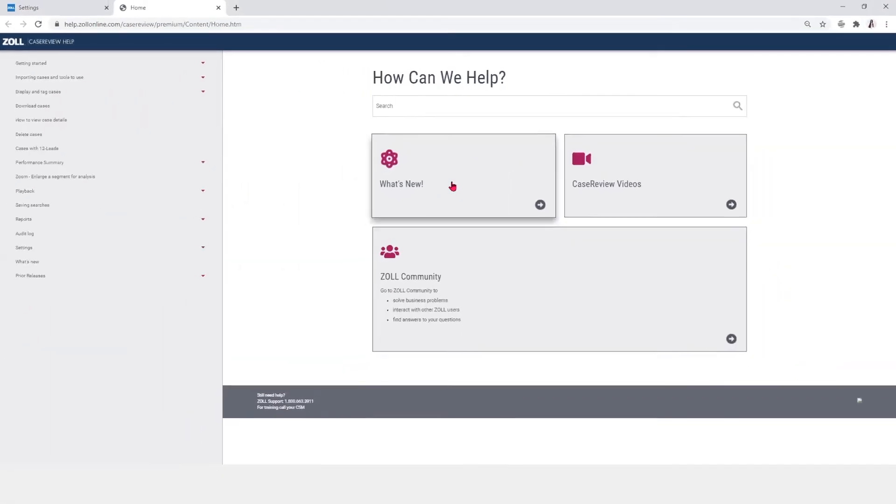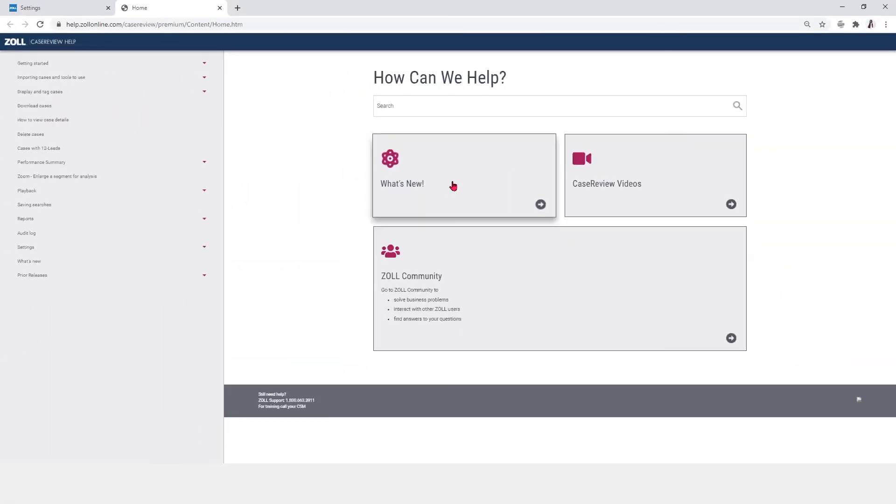The What's New section, if available, details new releases and improvements.